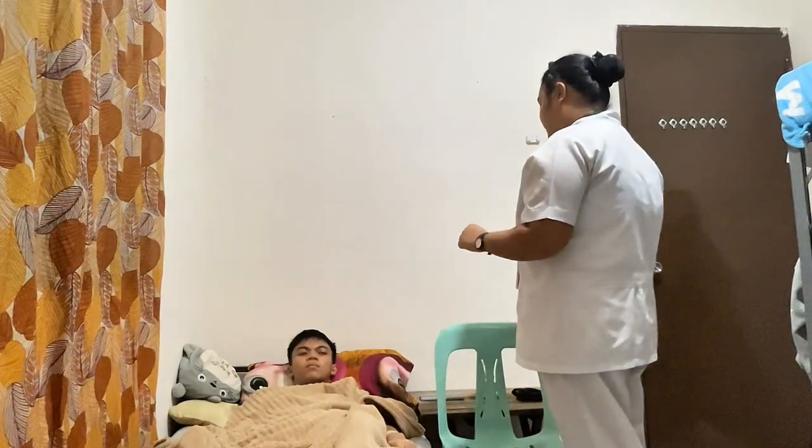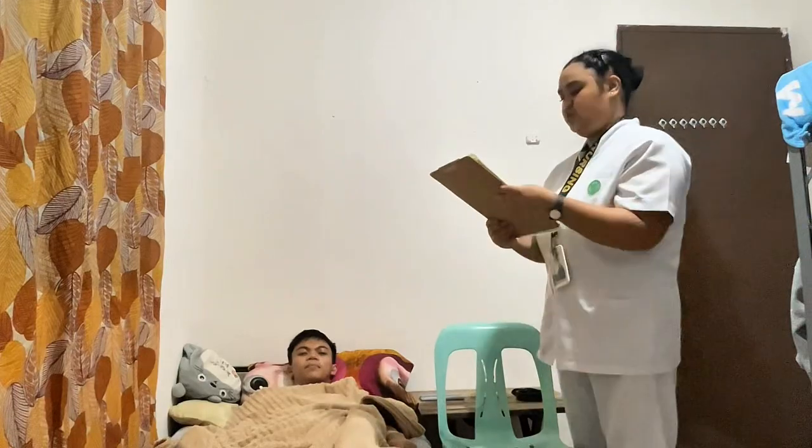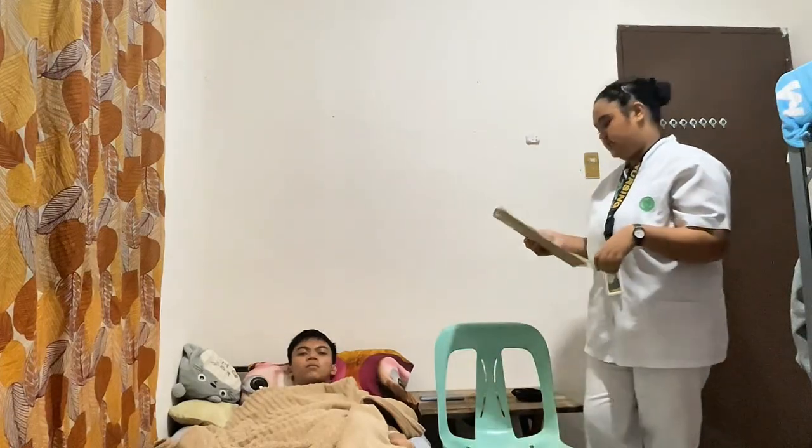Sir, are you comfortable with your position right now? Yes. So, since the patient is comfortable with his position, I will now adjust the height of the bed to the lowest position. This is to reduce the distance that the client has to step down, and lessen the risk of injury.